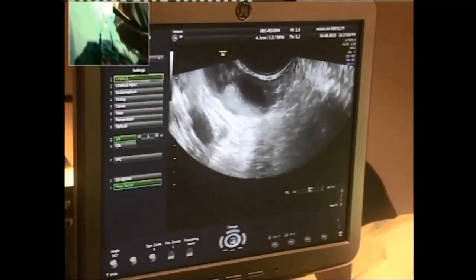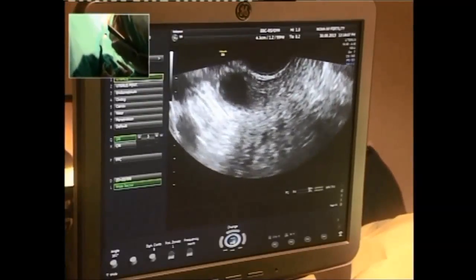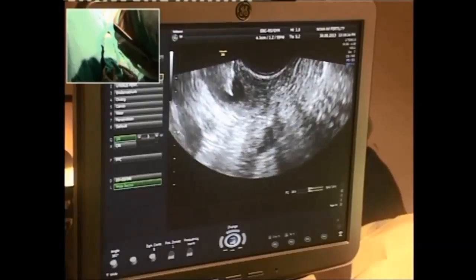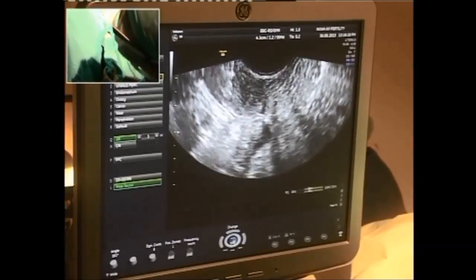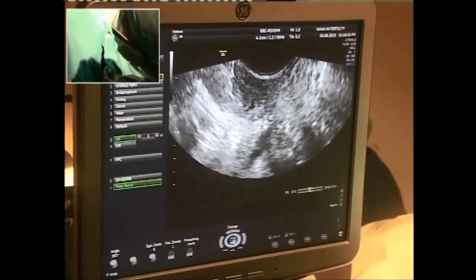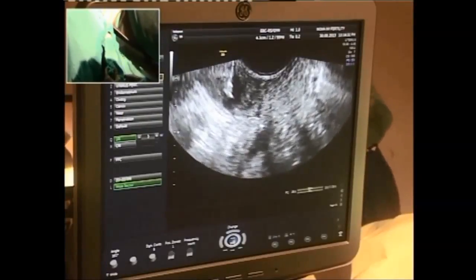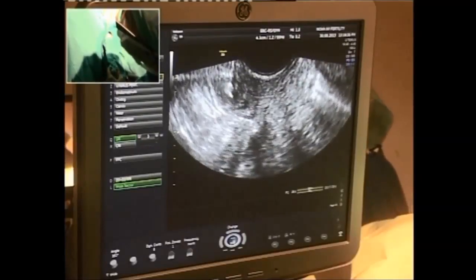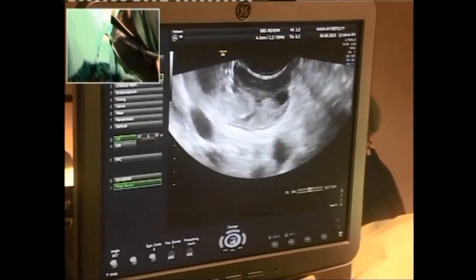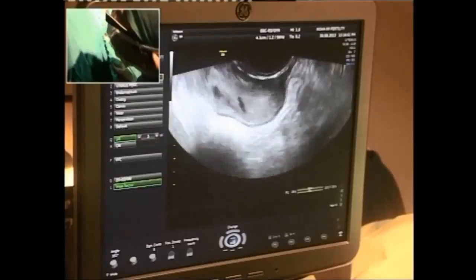Ideally we would like to wait to hear from the embryologist. So this is the follicle again — going in, aspirating completely, then pushing saline. The needle should not be more than 1 to 2mm inside, then re-aspirate. This is our flushing dual-lumen egg aspiration technique — done once to ensure the egg doesn't stick to the walls of the follicle cavity.